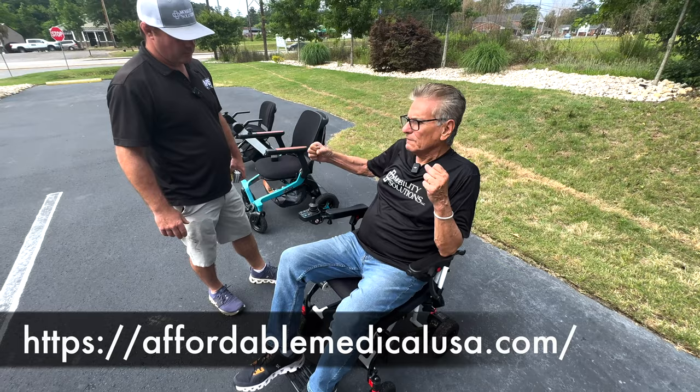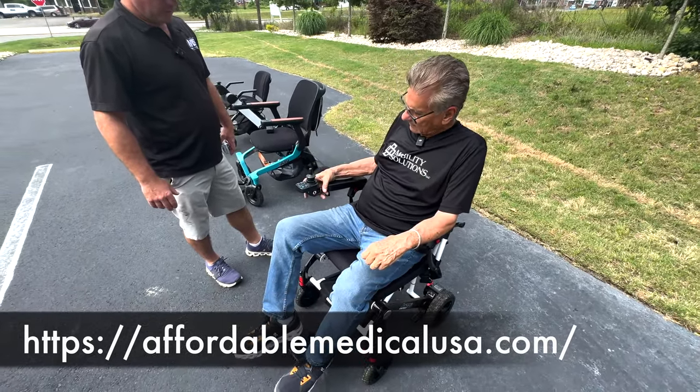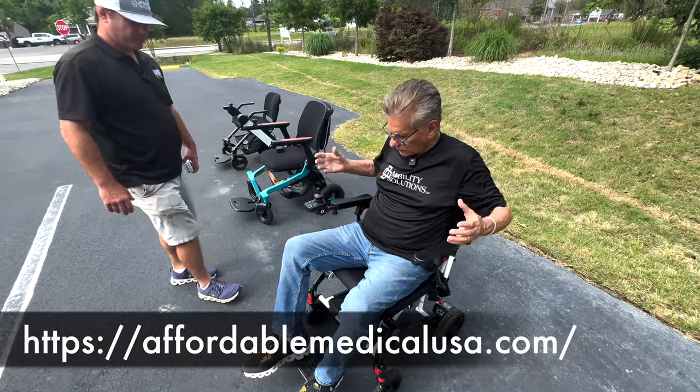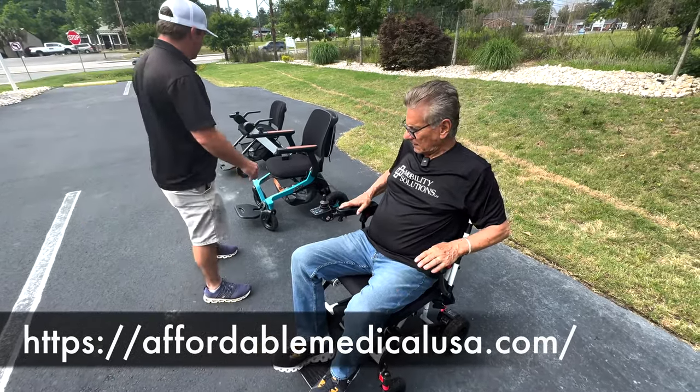Other wheelchairs feel a bit more sturdy. This is a little bit easier to maneuver, I would think. It's a lighter chair. You can feel it. But it's comfortable. Well, it's the carbon, so it's supposed to be light. Yeah, you want it light.